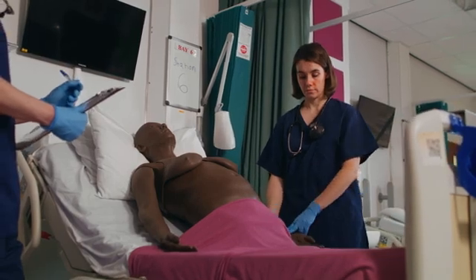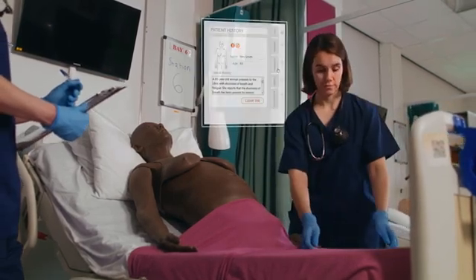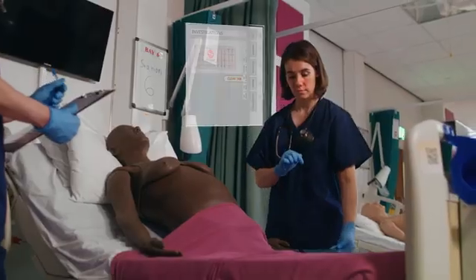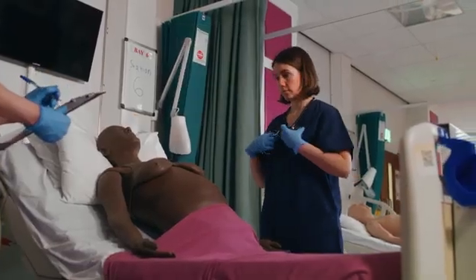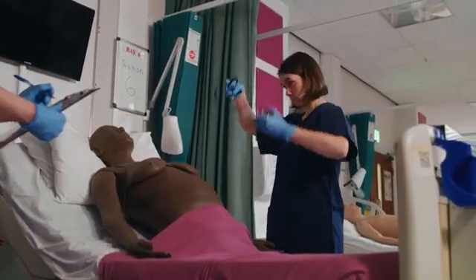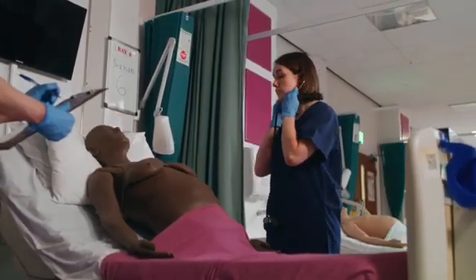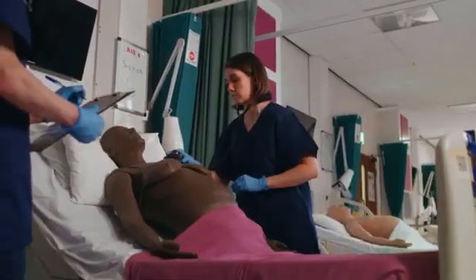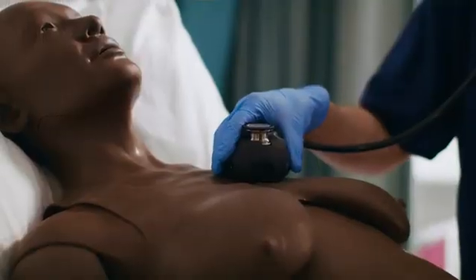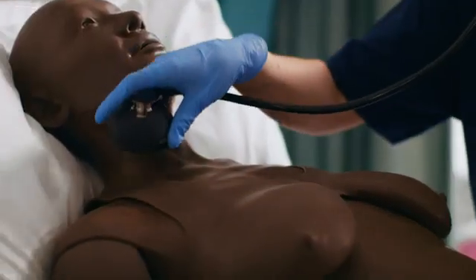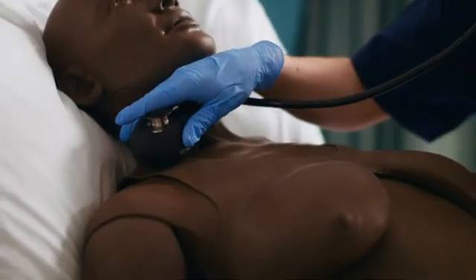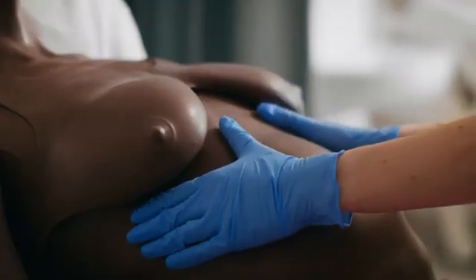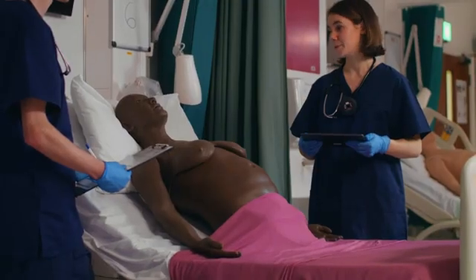Teachers can create unique assessments, editing patient history and investigation results, allowing students to practice the skills needed for clinical examinations and diagnostics. Developed with clinicians, CARE enables the teaching and self-directed learning of a range of respiratory and cardiovascular examination skills, increasing the speed and accuracy of skill acquisition for all learners.